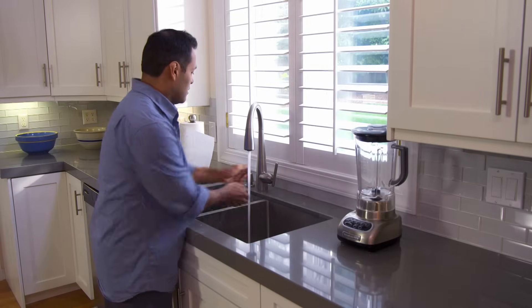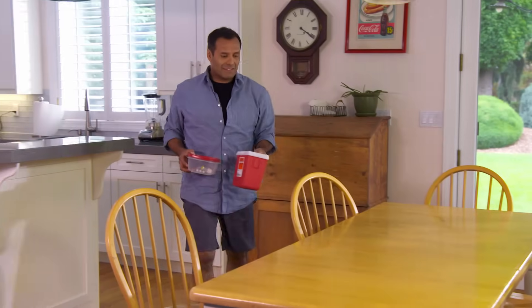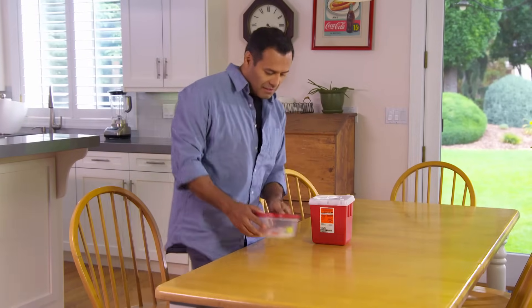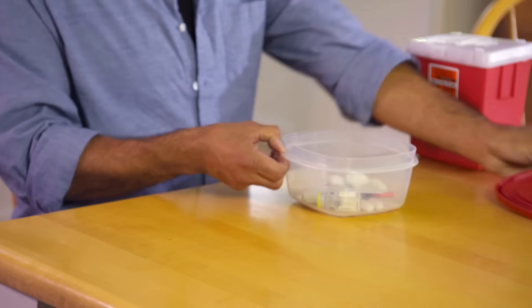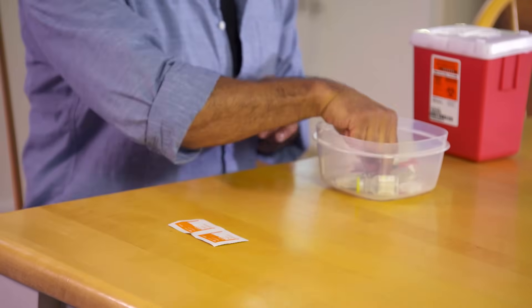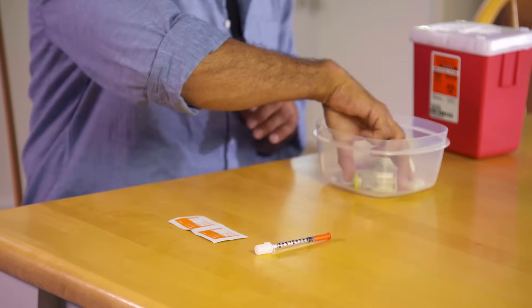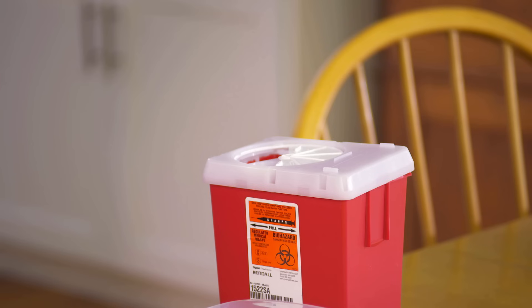Start by washing your hands with soap and warm water. Before giving the injection, check your supplies to make sure you have everything you need. You'll need alcohol pads or cotton swabs dipped in rubbing alcohol, a disposable syringe, the vial of medicine you'll be using, adhesive bandages, and a container to safely dispose of the used syringe.